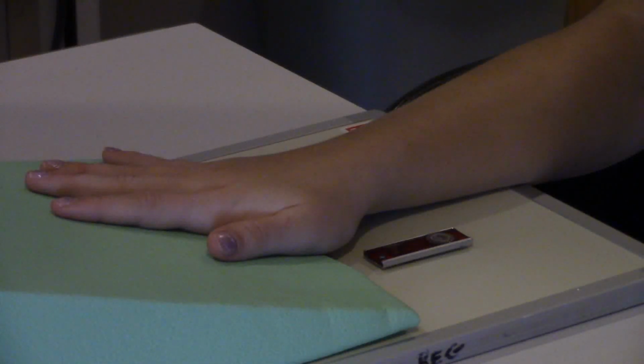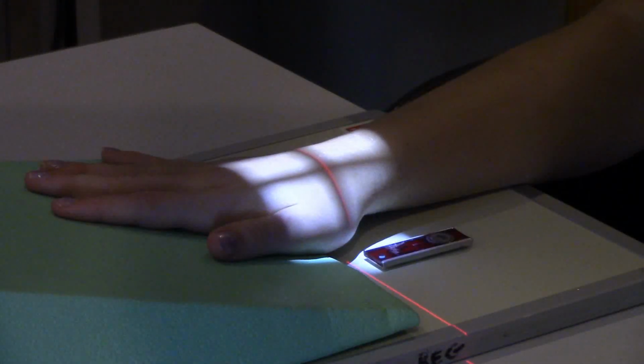So like you were saying, for an abdomen, you're going to put your marker low and to the edge of the film. That way you're pretty sure, because we don't really care if it's on the greater trochanter, as long as the doctor can see all of the patient's bowel tissue. But for extremities, it's pretty easy.